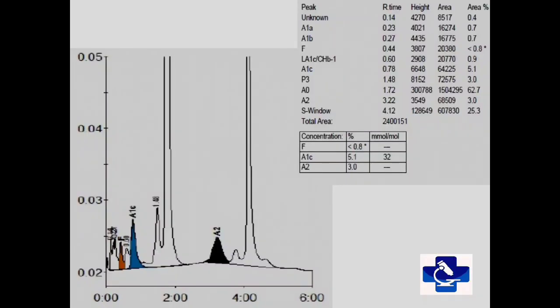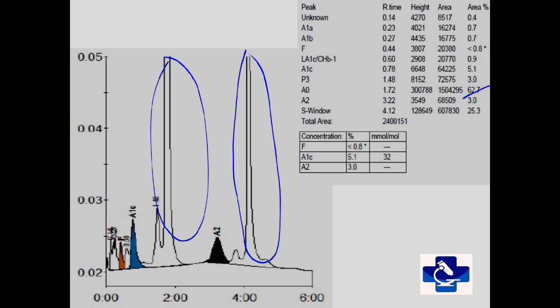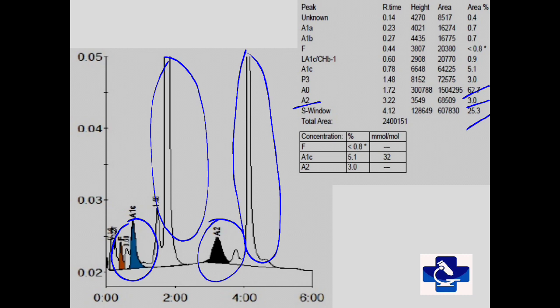In this HPLC graph, we have hemoglobin A0 of near about 62%. There is an S window in which we can see 25.3% of hemoglobin falls. A2 is about 3% and other fractions including hemoglobin F are within normal range. So this graph is of sickle heterozygote, also called sickle cell trait.